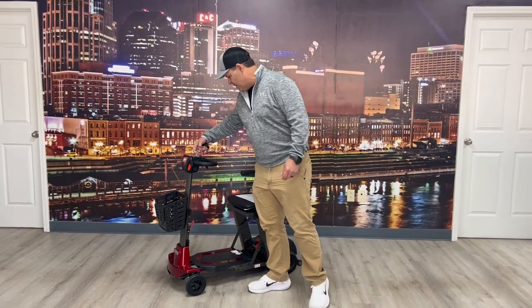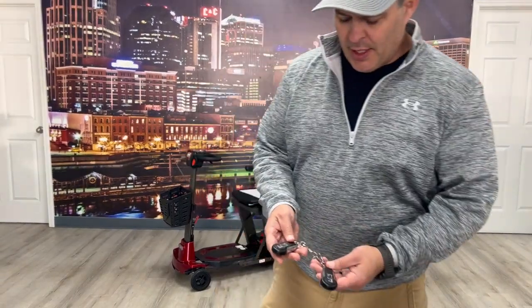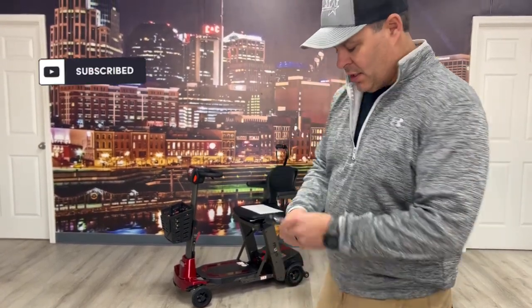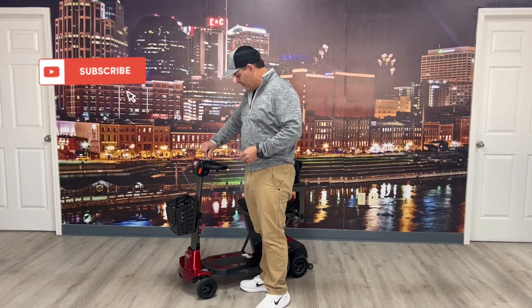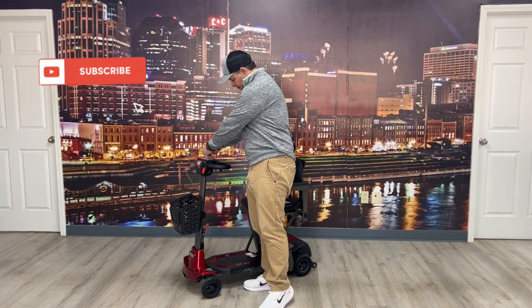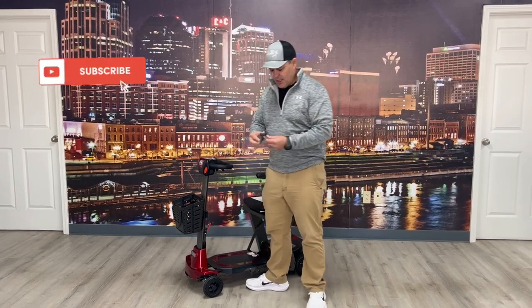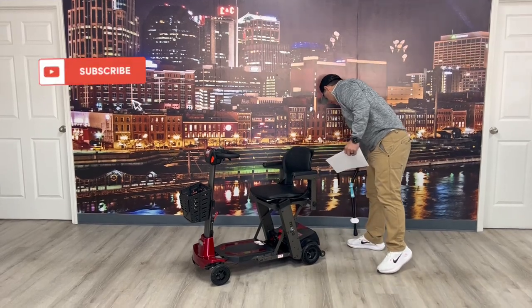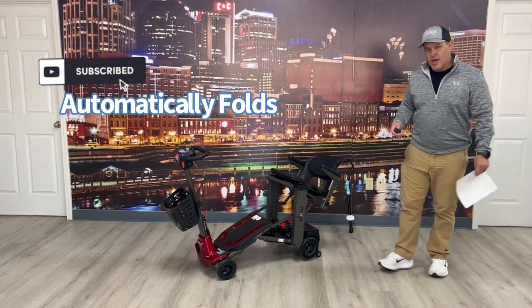I'll start out by showing you the initial thing that's pretty cool about it — it comes with two keys and actually two key fobs. These key fobs are going to allow you to auto-fold the device. To do that you have to turn the device on. All I've got to do is push this button and it will automatically fold.